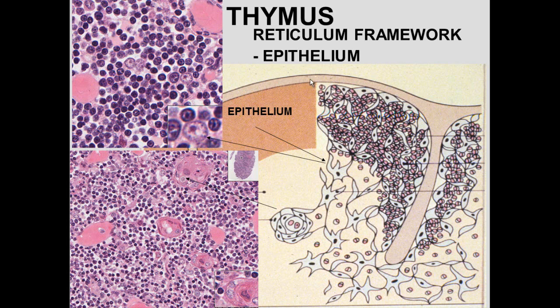A capsule surrounds the thymus with septa projecting inward. The cells in the thymus are epithelial reticular cells that make a reticular network throughout. This is the cortex, where the blood-thymus barrier is located — the barrier is in the cortex, not the medulla. We can see epithelial cells with a large nucleus and prominent nucleolus, and a high density of cells in the cortex versus less density in the medulla, which also contains Hassall's corpuscles.